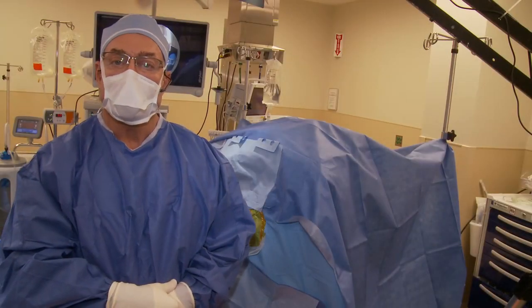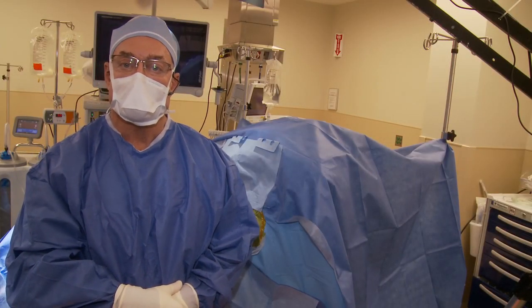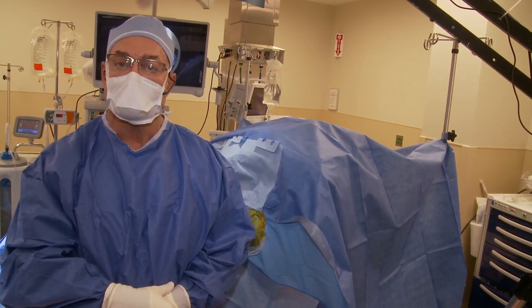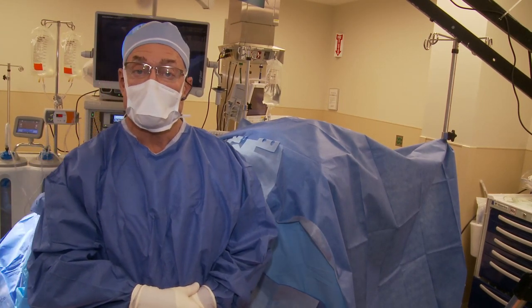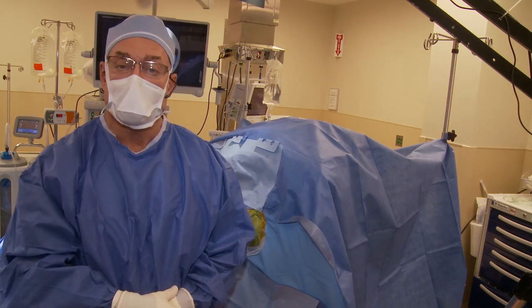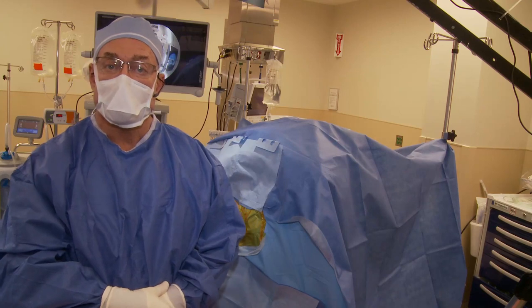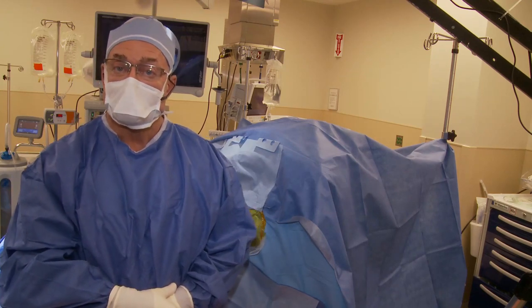Hi, I'm Dr. Anthony Romeo, and today we're going to demonstrate an arthroscopic rotator cuff repair, acromioplasty, and biceps tenodesis. This otherwise healthy and very active 48-year-old gentleman fell off of his mountain bike and injured his shoulder. He went through appropriate conservative treatment, and his symptoms did not improve.